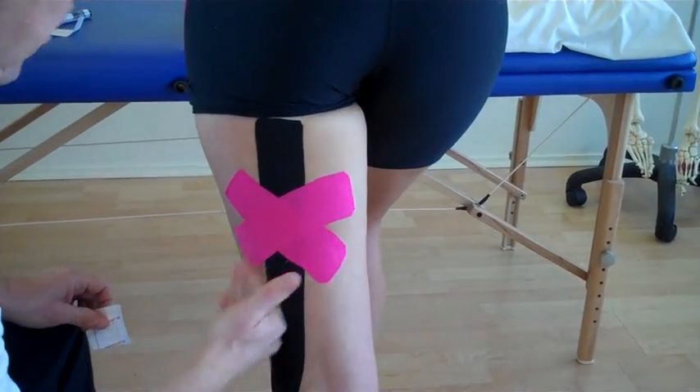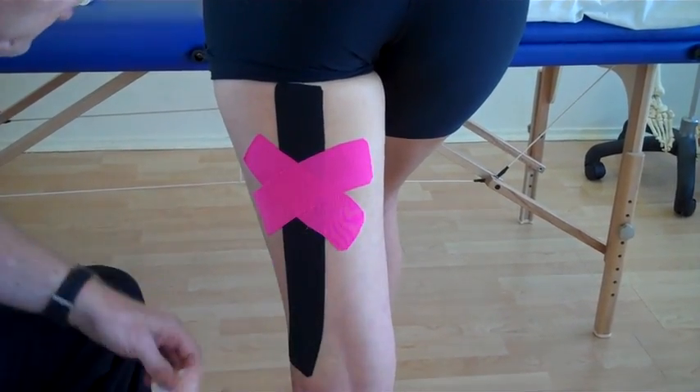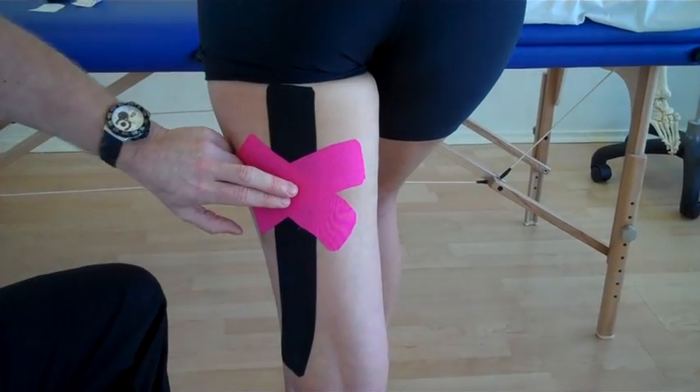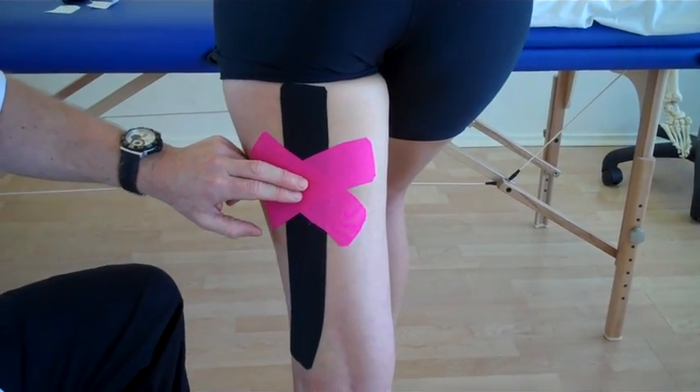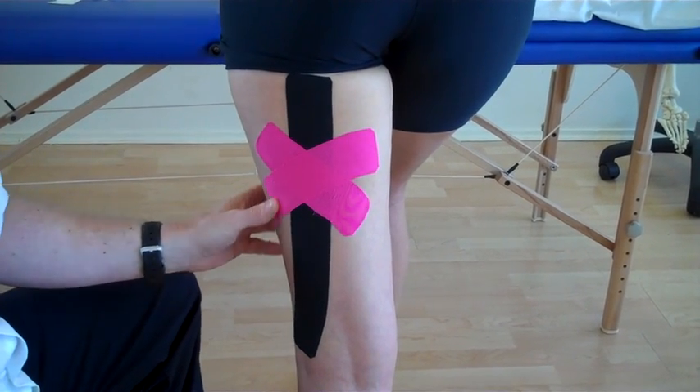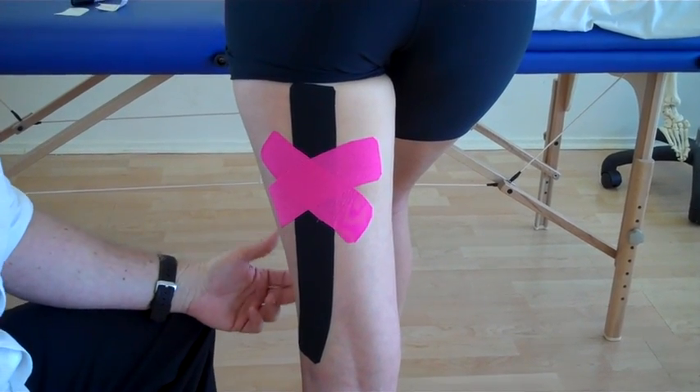And there we have kinesiology taping using functional tape to stabilize the bicep femoris, which is part of the hamstring. For further training on kinesiology taping, look up John Gibbons at bodymaster.co.uk.